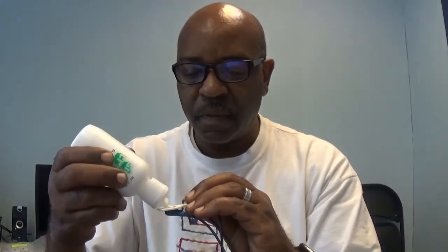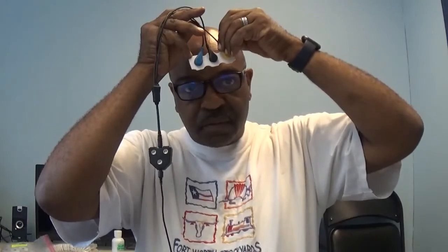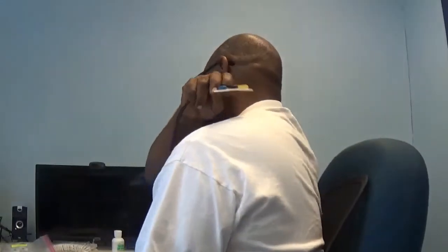Let's see what that looks like. I'll just put some in here. So this is what you would do. You put some gel in there. You do that for all three. And then you peel the backing off. There's a paper backing here. You peel that off. And then you stick it on, either could be on the forehead, another placement might be on the arm, extensor on the arm, or other places like the trapezius and so on.